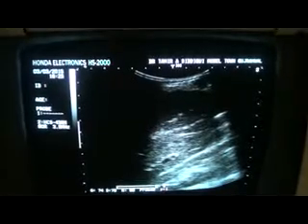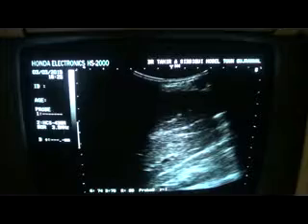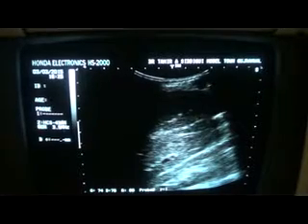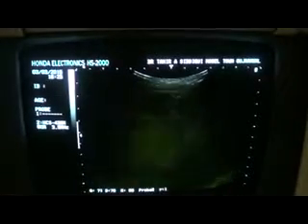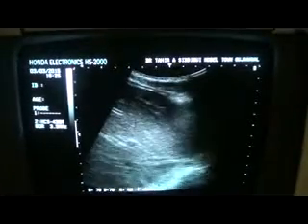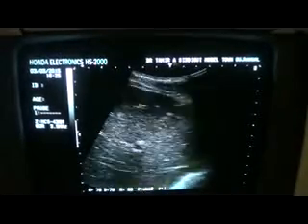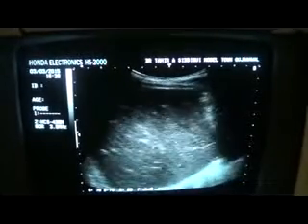I am going to show you the liver now, and you can see its echogenicity has gone down significantly. You can see the prominence of the minor portal vein radicals. From another section, it gives a starry appearance of toxic liver — not that of a congestive liver, because the hepatic veins are not dilated.